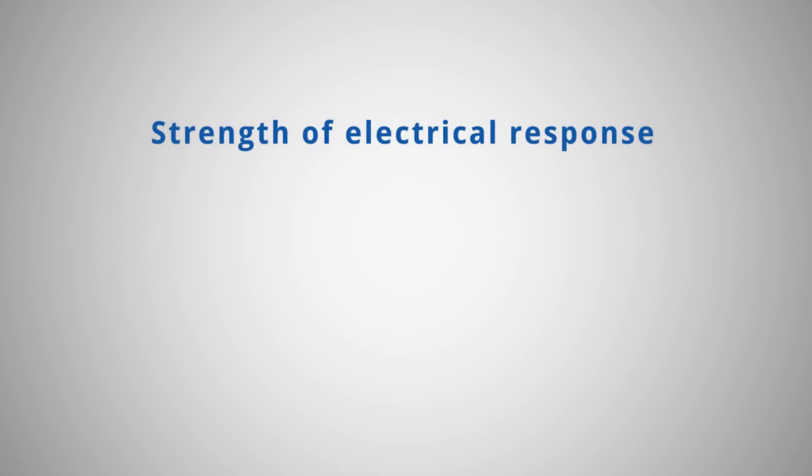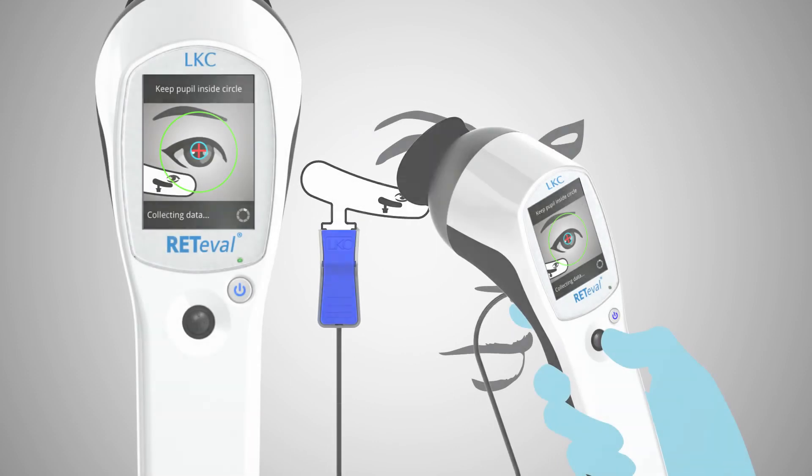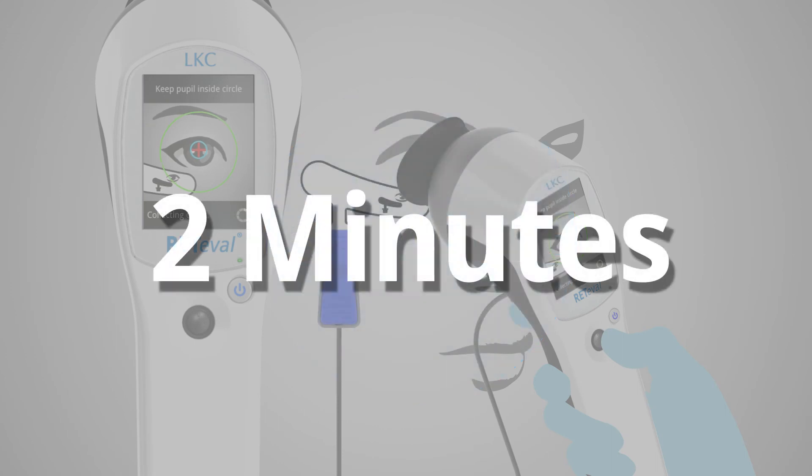Redaval combines the strength of electrical response, delay of the electrical response, and the pupil size response from three different flash intensities to produce the score. The operator will continue to see the eye throughout the test, which typically lasts 30 to 45 seconds per eye. The average patient testing time is around two minutes.